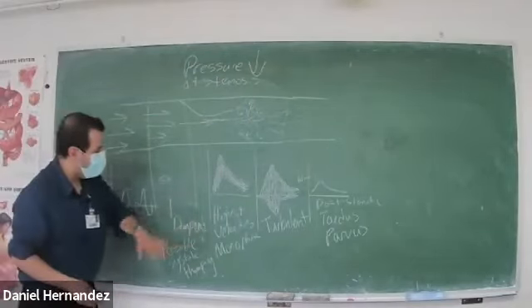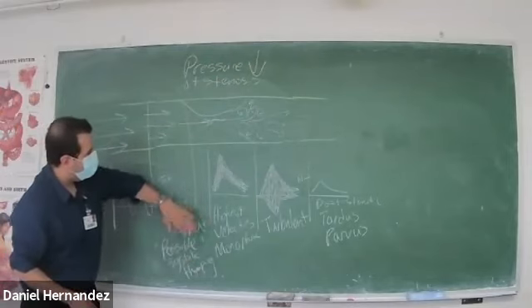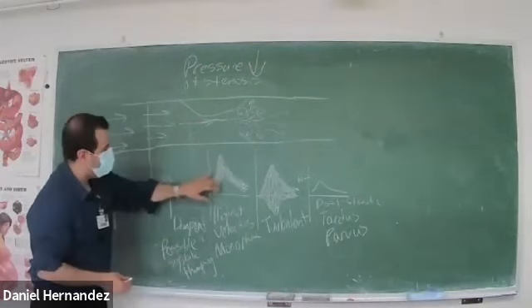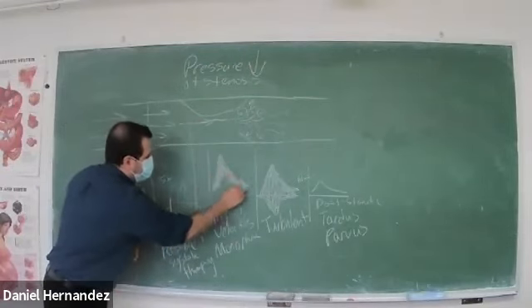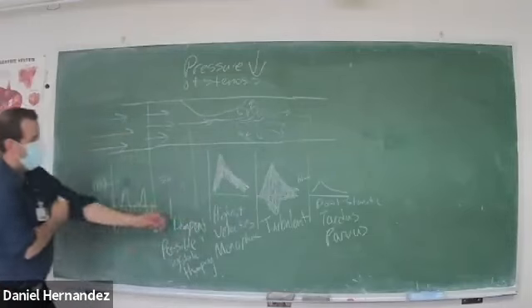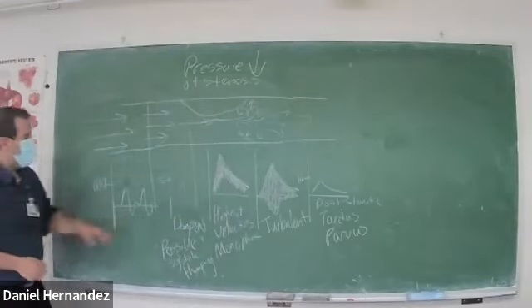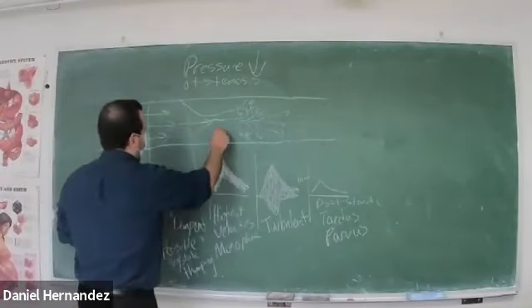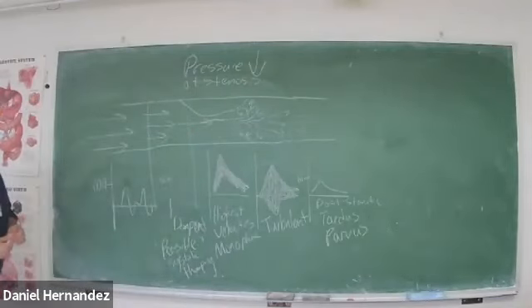You'll now wind up with a monophasic waveform, very fast velocities. Depending on how fast it is, you'll get filling in of that spectral window, you'll get spectral broadening. But this is where your maximum velocities are going to be. And that's where your pressures are going to be the lowest within that stenosis.